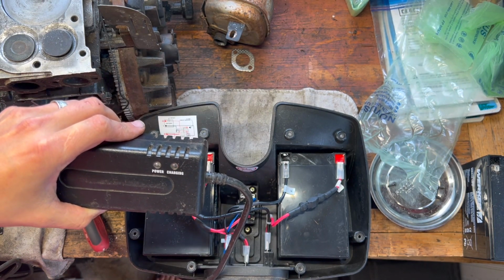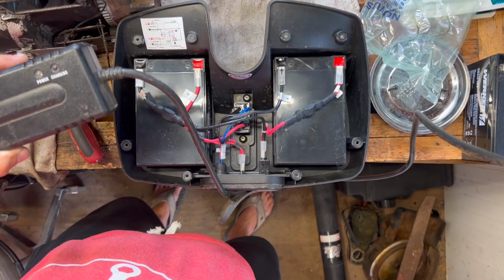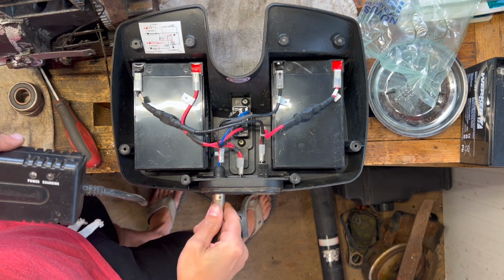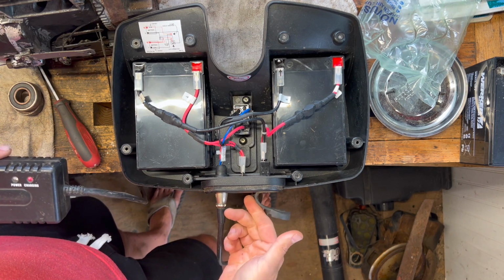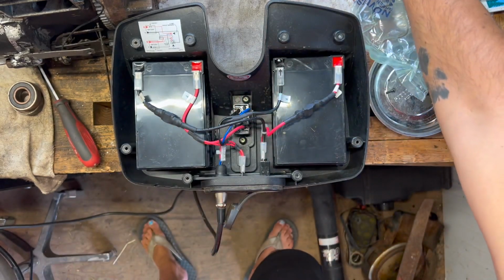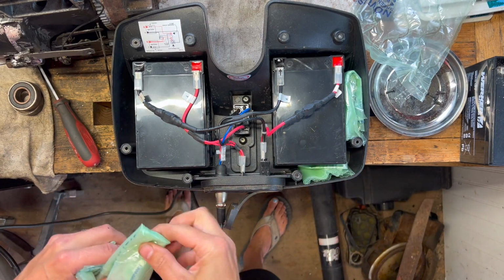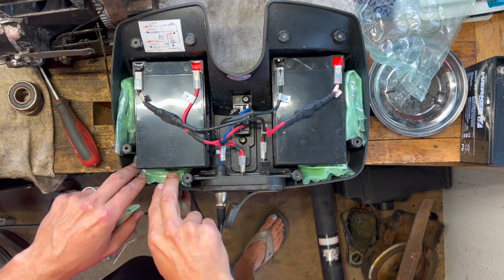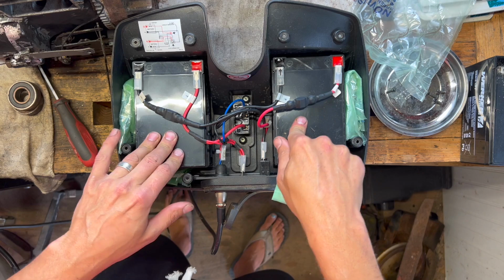Still don't know if this button in the front is power on or off. It said it was a breaker reset, so I'm not sure. I'm not sure why it would have a breaker reset and this fuse, but we know it's charging, so I'm assuming that means that we're good to button this back up. So I'm going to stuff in the padding that they had in here, just these plastic baggies, and we can get this buttoned up, throw it on the machine, and see what happens, I guess.